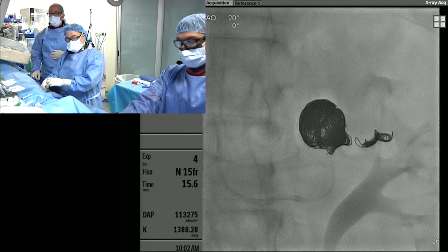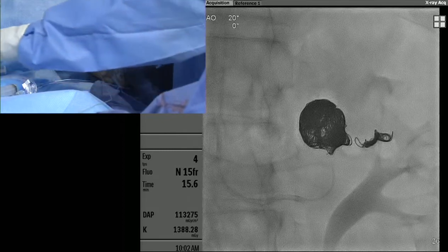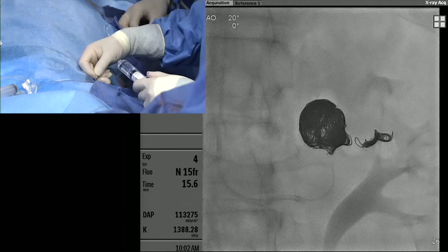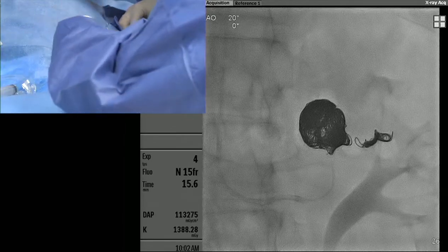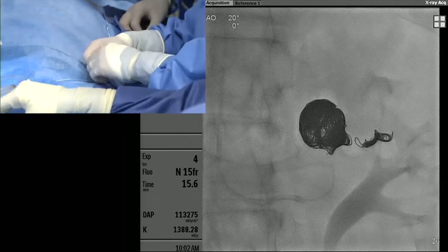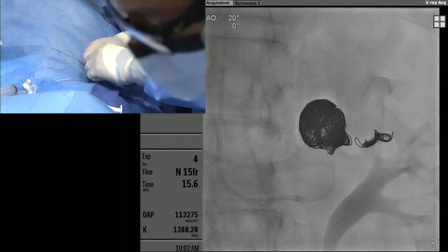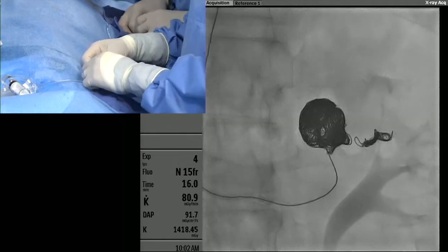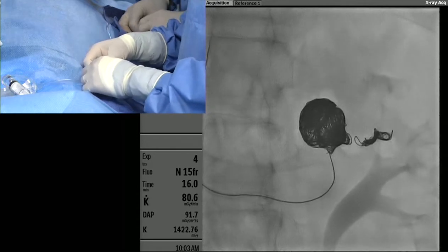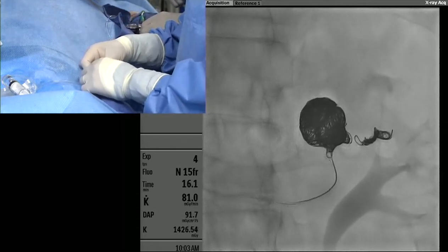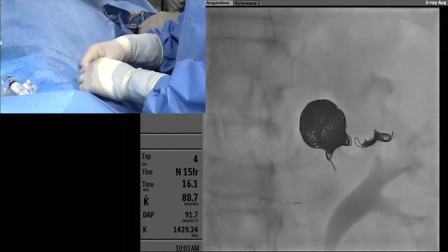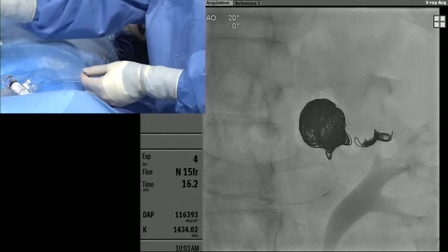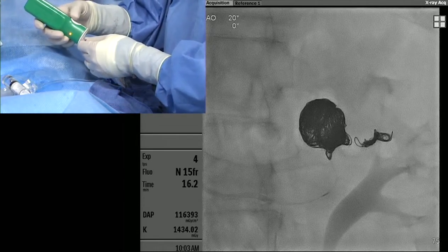If the patient were taller we would be limited in our shapes. This Sherpa guide catheter has a nice shape and works well in this anatomy, but with a taller patient we may need 110 or longer. I really like the Sherpa for distal renal and distal SMA interventions. It looks like you're hubbed at the sheath — this 100 cm guide cath is totally hubbed — and with a long microcatheter the working length is just very nice right now.